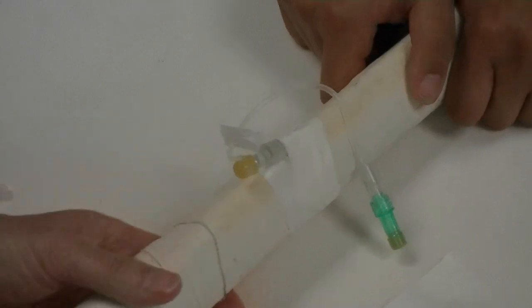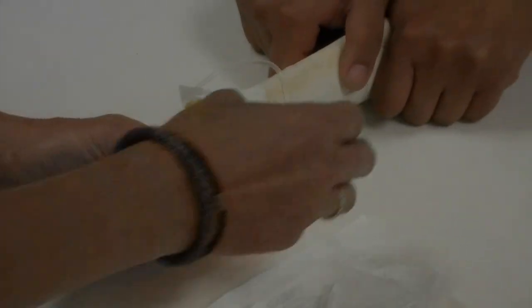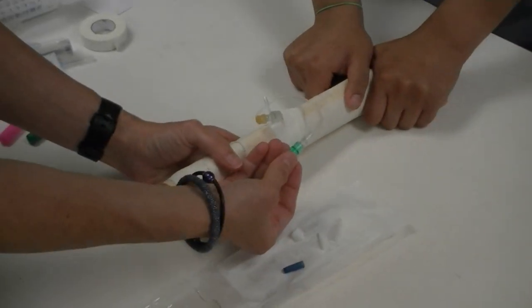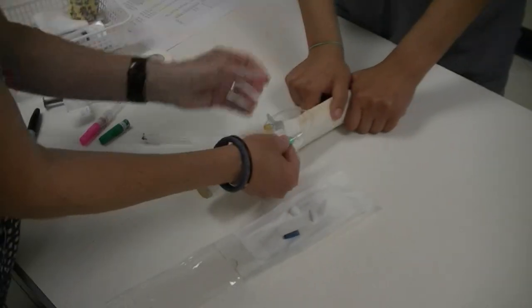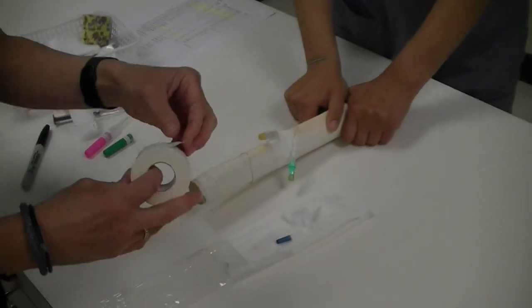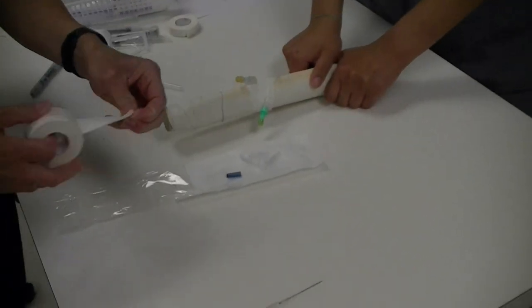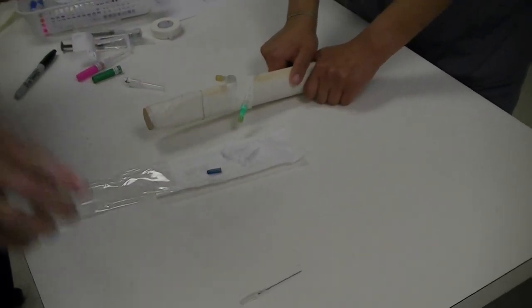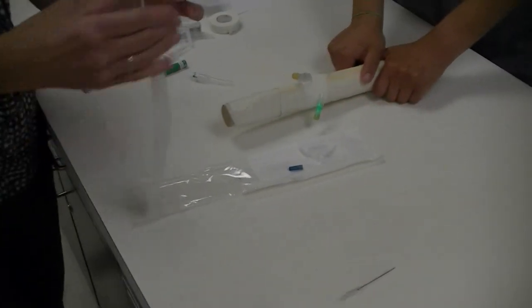The only thing remaining is that I need to secure this additional accessory injection port. To do that, for a large dog, I'm going to use brown one-inch tape.